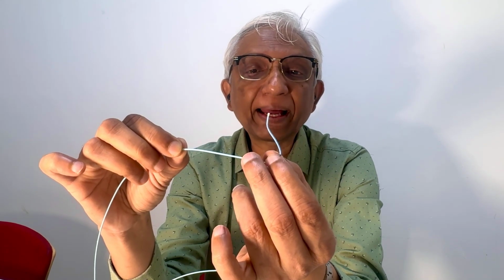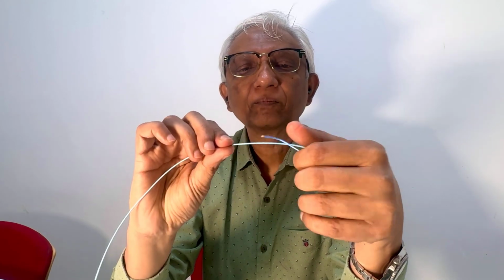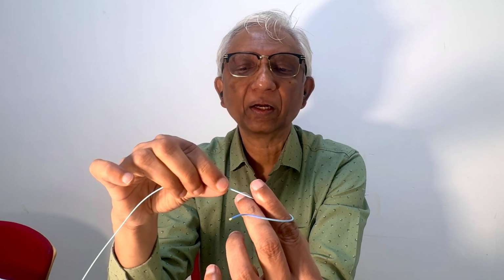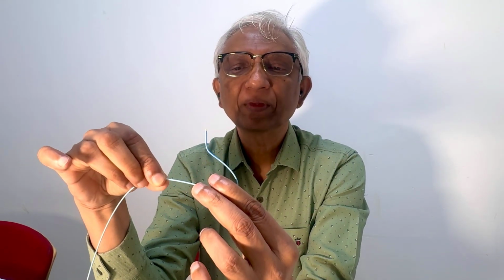It's difficult to track these catheters because of the tight angle. Now imagine if you're using this in a very unfolded aorta, you need this catheter, right? Why does it happen? Because the innominate artery is very low. It's almost at this position in the arch. And now from this position, when you pull it up, you engage it and you open it up, right? Then you pull it out, rotate it out, pull it a little, make it straight, and you engage the left carotid artery.